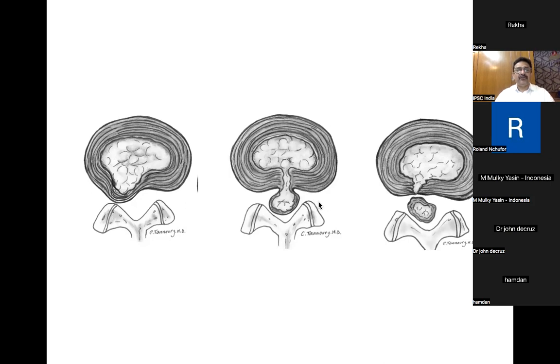In this case, you may not require going inside, because if you see here, there's the outside-in technique. Basically we have to go inside, look at it over here, and we can extrude, take out from here also. We don't have to go inside in this case because there's hardly any tail over there, because this portion is bigger. So you will be able to extract it from here only.